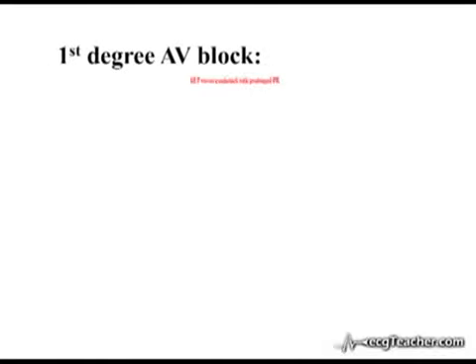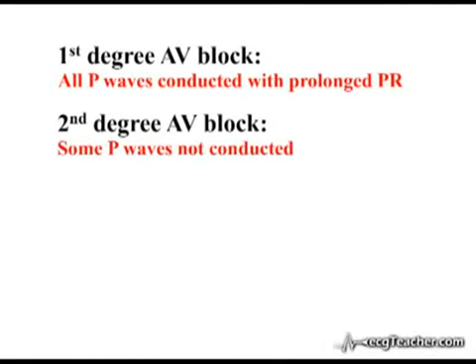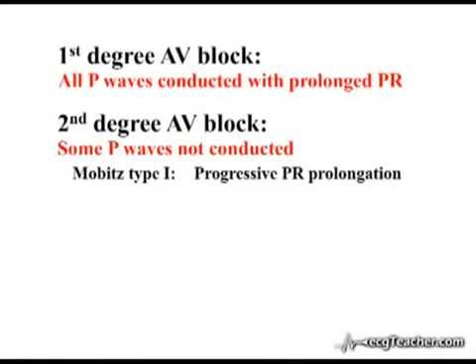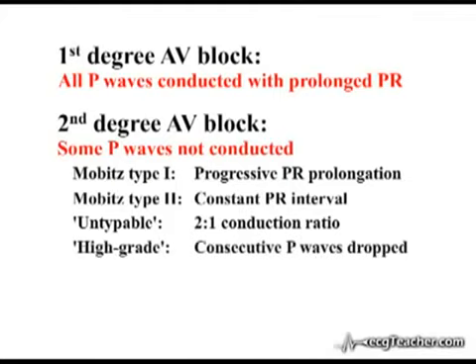This slide summarizes the material covered in this video. There is disagreement in the literature, particularly with regard to the precise definition of some subtypes of second-degree AV block. We would recommend that you stick with this nomenclature.